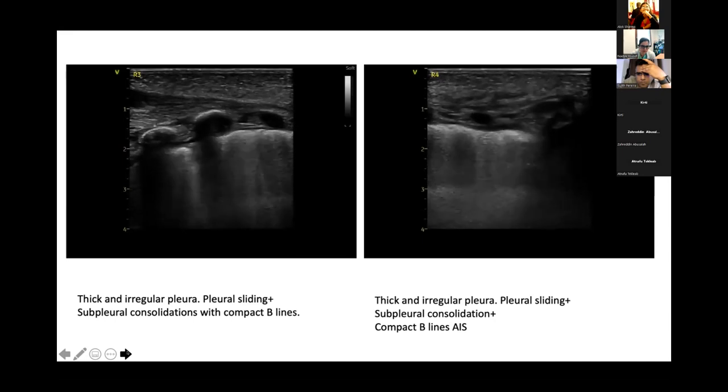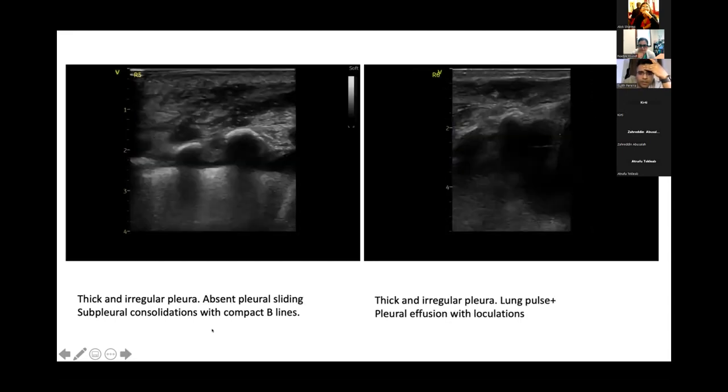But of course, the pleural line is extremely irregular all over, with small consolidations. And I'm curious how that turned out once you treated the lung and increased the ventilation. So the baby is actually better, having been in about 40 to 60% oxygen when I did the scan over the weekend. Now the settings have come down, so they're in about 30% oxygen on a mean airway pressure of about 8 to 9.